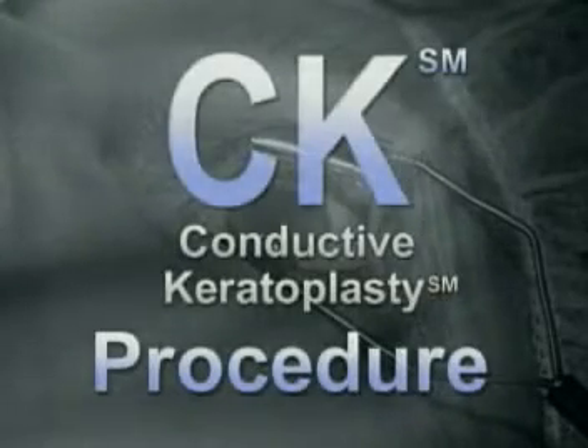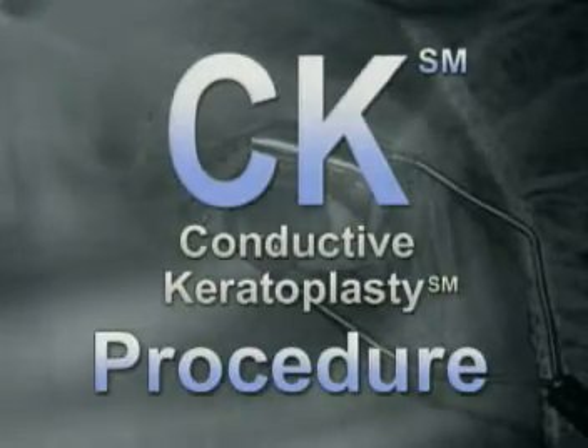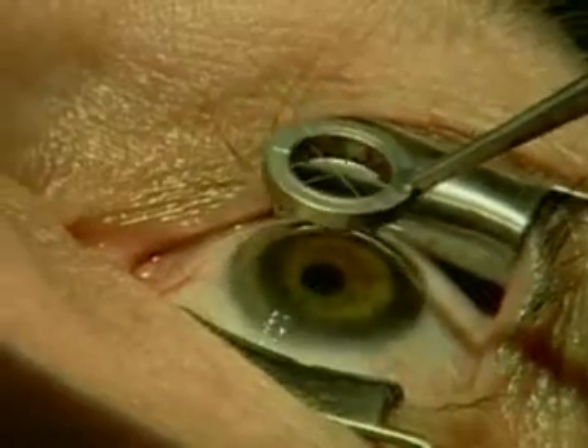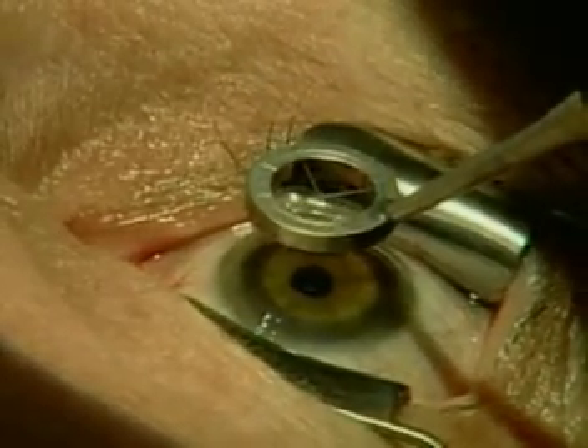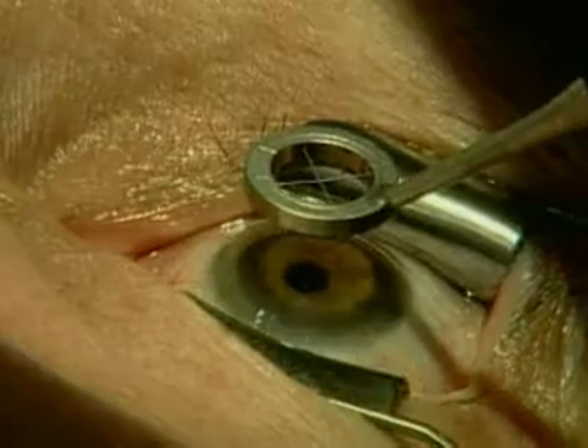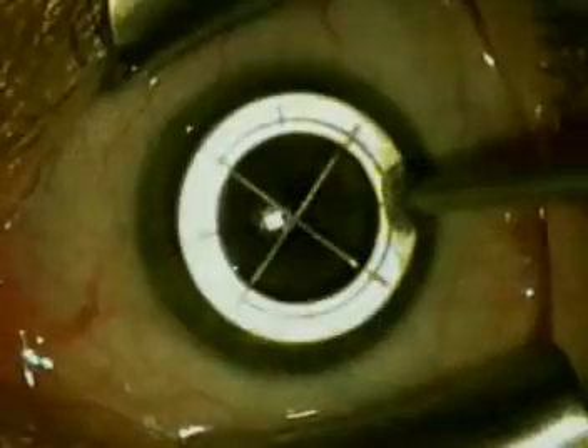We're going to see a demonstration of the actual conductive keratoplasty procedure. Here's the closed bladed wired lid speculum that serves as the ground for the complete radiofrequency circuit. The cornea is marked with a specially designed marker.